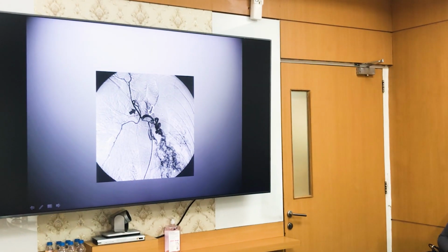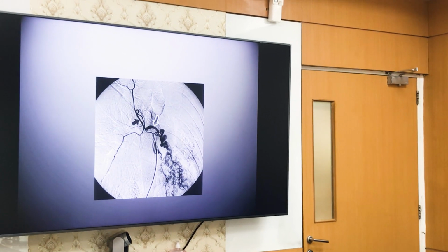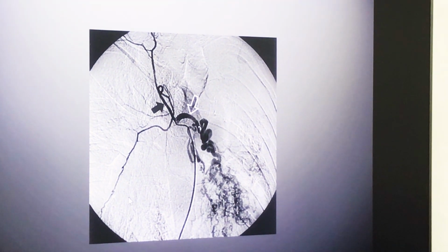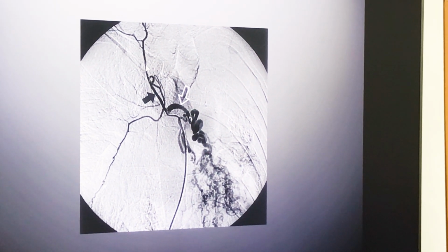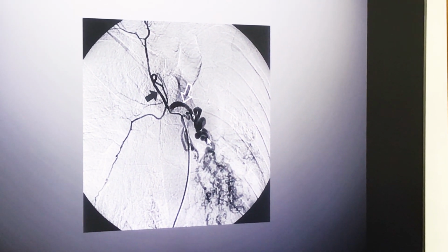And this is how it sometimes looks. This is a very sick patient, cystic fibrosis actually. Chronically they have been bleeding off and on, and the bronchial arteries are so large here, and these are all abnormal bronchial patterns. So this is neovascularity in the lung. Bronchial arteries are trying to compensate for pulmonary artery problems, so they have proliferated. You see the proliferation here. And this branch, which goes to the upper side, is actually an intercostal branch. So we don't want to intervene there. We want to intervene into the bronchial artery path only.